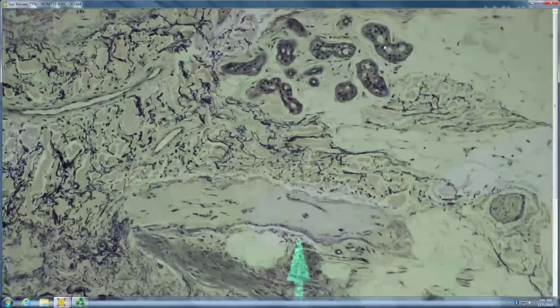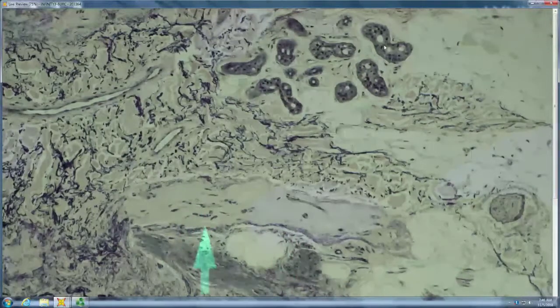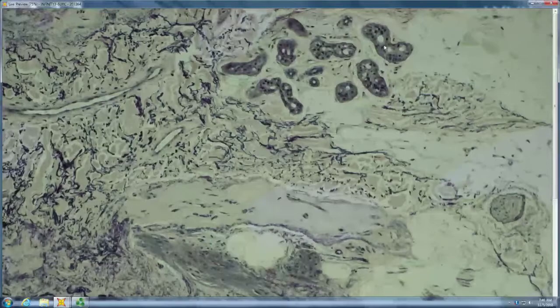There's nothing wrong with it, right? It has normal vascularity, the blood vessels are there. That's normal. That's going to be between anagen and telogen, or in an involutional pattern alopecia, where the hairs just peter out, but there never was inflammation there, right? And so there's nothing that ever damaged those fibrous tract remnants.